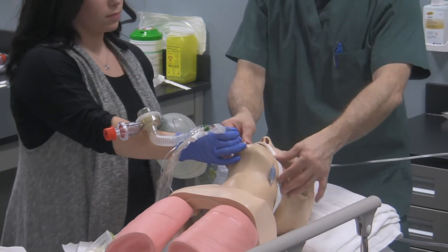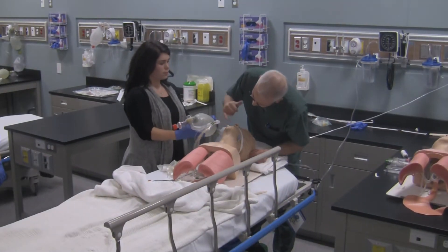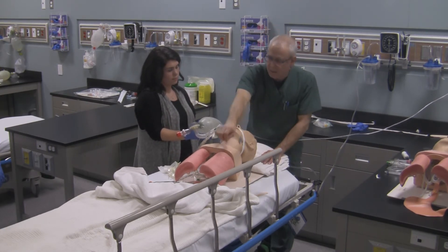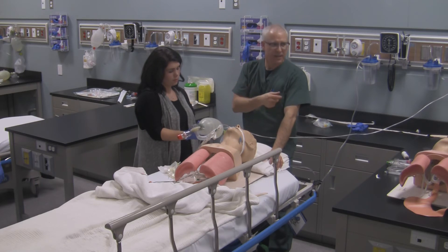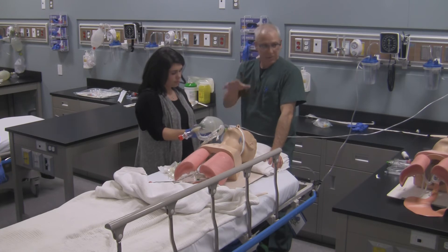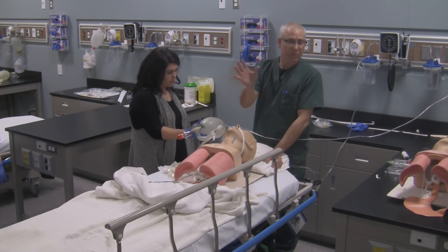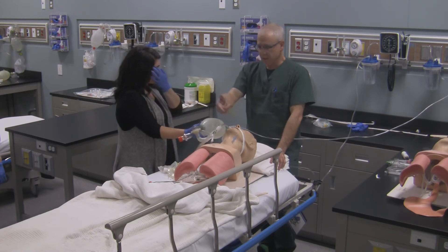Once that tube has been taped — all four pieces on the patient and on the tube — you can let go and check your marking. I'm still at 21 at the teeth, 22 at the patient's lips, so the tube hasn't moved. Grab your stethoscope, listen for good air entry, check your vital signs. Call for a chest X-ray. Once cuff pressure check has been done, you can get ready to suction the patient's endotracheal tube if needed.